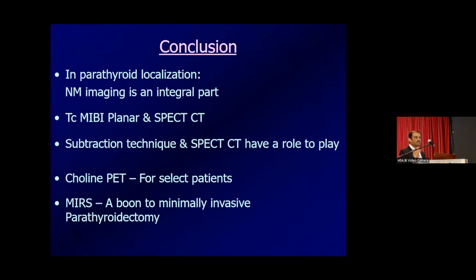So what we have discussed, what we have learned in the last 30 minutes: nuclear medicine imaging is an integral part in the parathyroid localization. Almost always we will be doing a planar scan, but we know now what will be the impact of SPECT-CT, who are the patients to undergo a SPECT-CT. We should selectively use subtraction techniques and SPECT-CT in our day-to-day practice. MIRS is a very, very good technique. I think it should be popularized in your country. I am there. Whenever you call, I will come back to show how it is to be done.